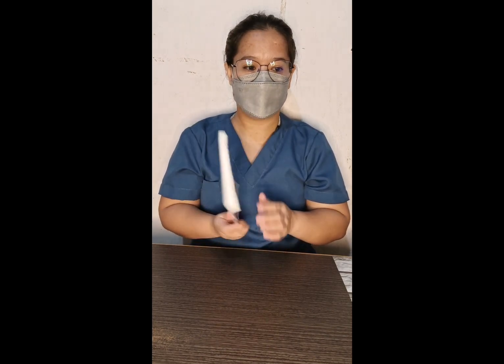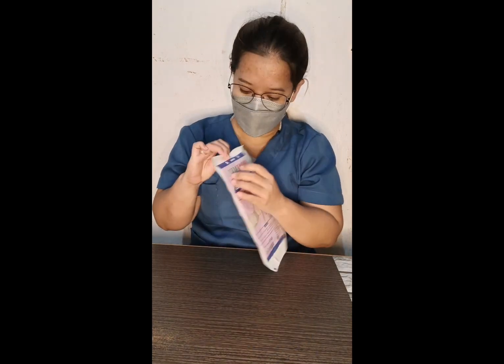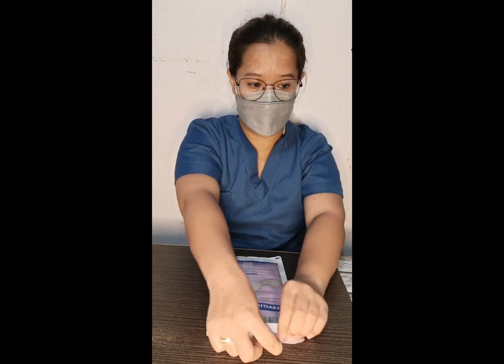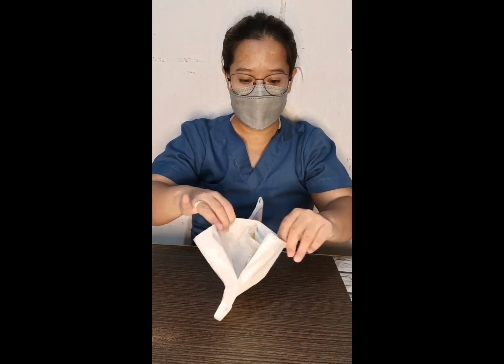So this is our surgical gloves. Make sure that the size of the gloves fits your fingers perfectly. We need to open it. There is an instruction on it, so we need to open here. Open the outer wrap of the sterile glove pack. Okay, so we need to open this one as per the instruction.